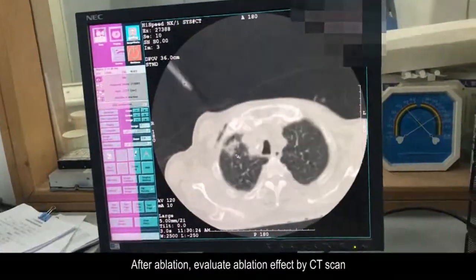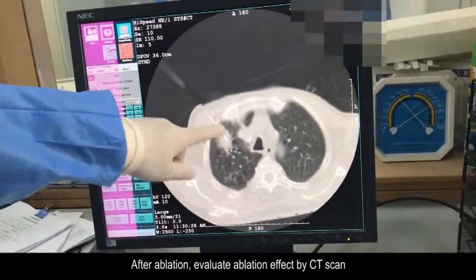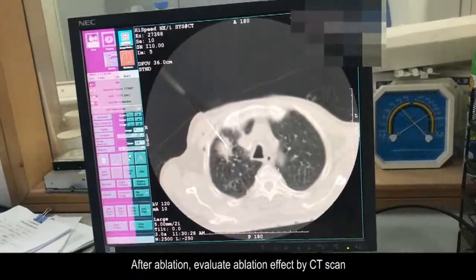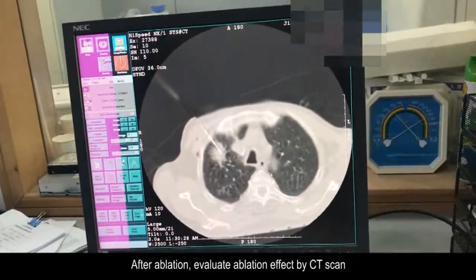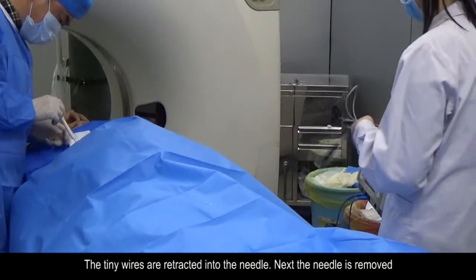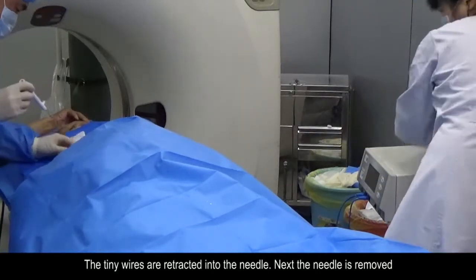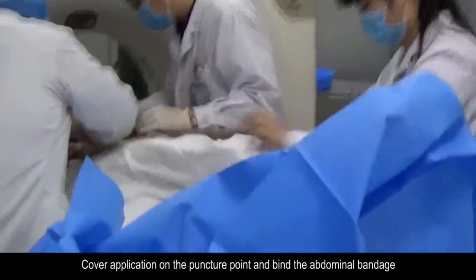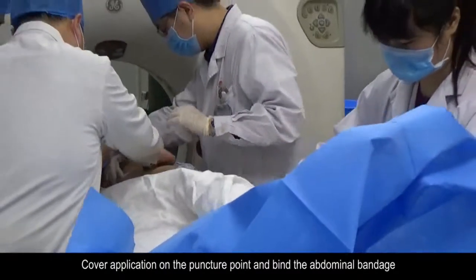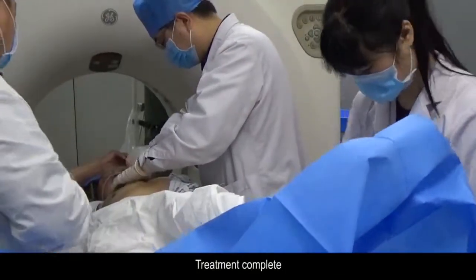Check the ablation effect by CT scan. The tiny wires are retracted into the needle. Next, the needle is removed. Apply cover on the puncture point and bind the abdominal bandage. Treatment complete.